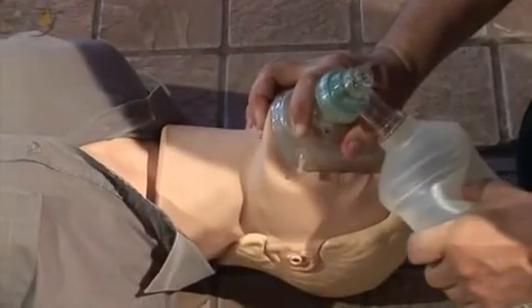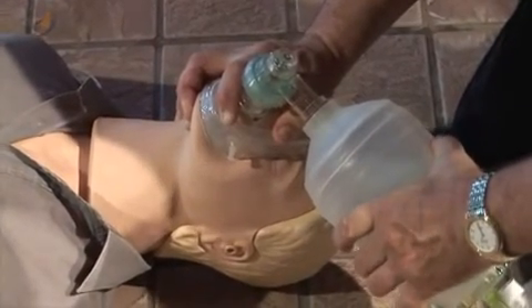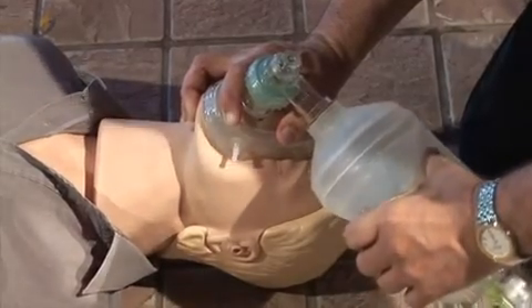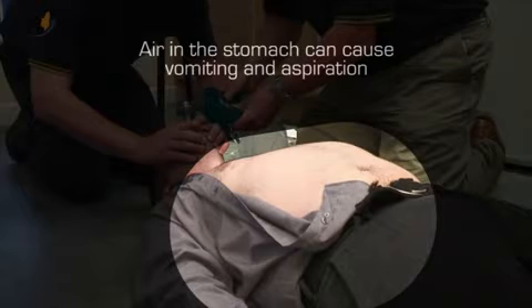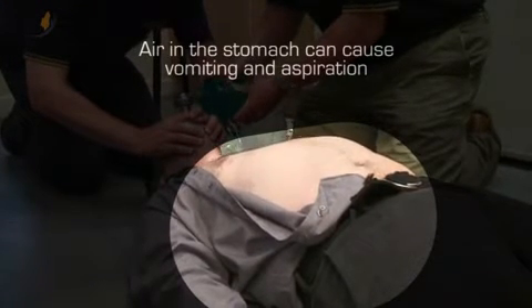With the second hand, the bag is squeezed for one second with enough air to just see the chest rise. Squeezing the bag should not be done too quickly or forcefully, as this will cause air to go into the patient's stomach. If too much air enters the stomach, it can cause vomiting and, potentially, aspiration.